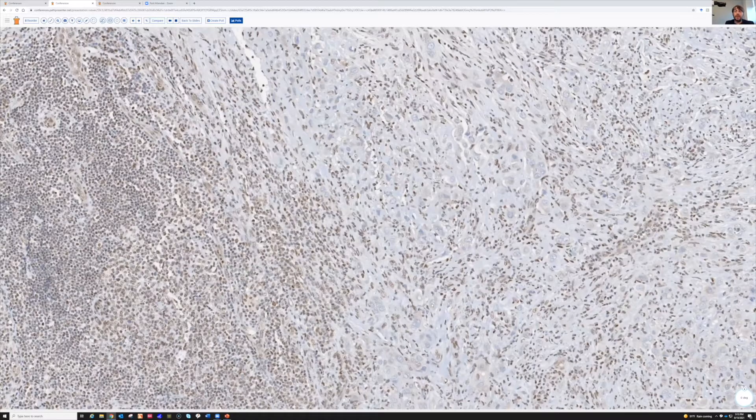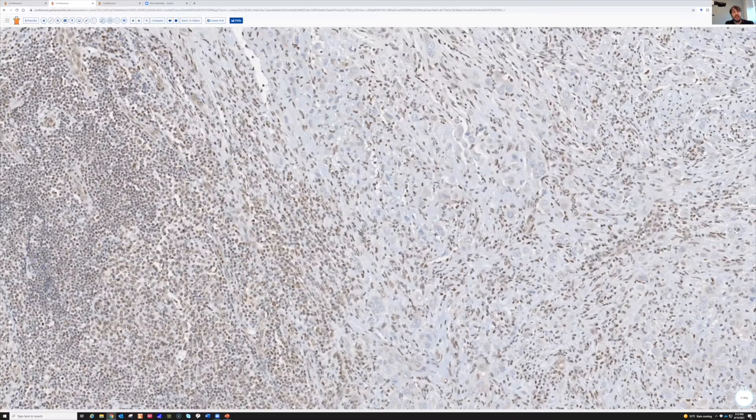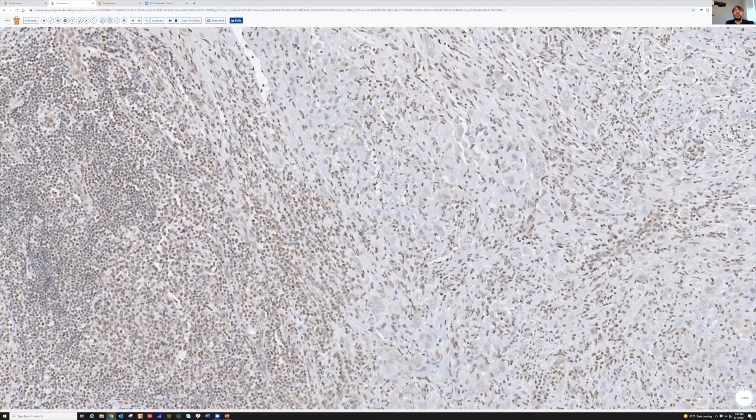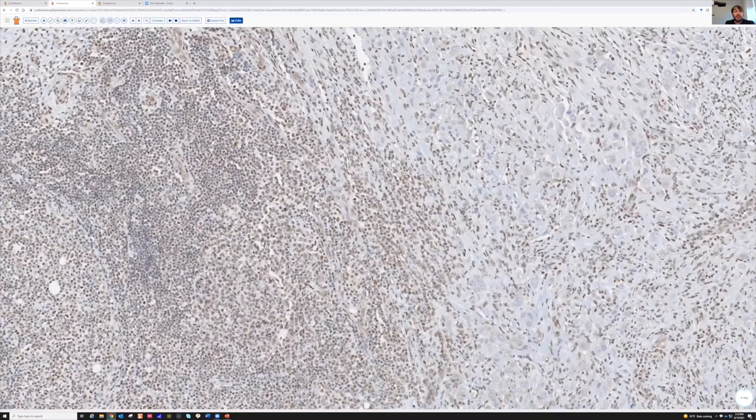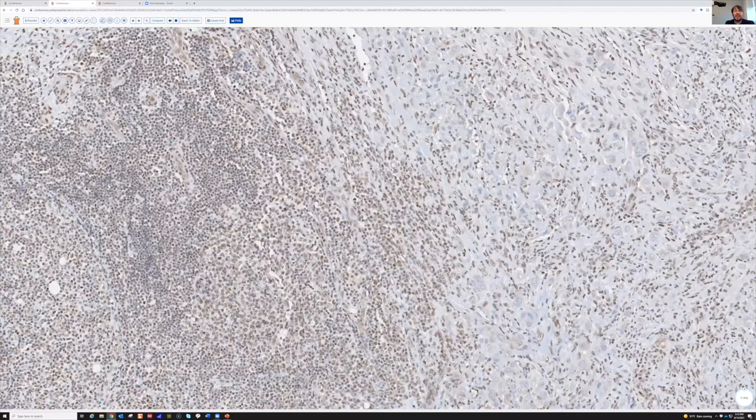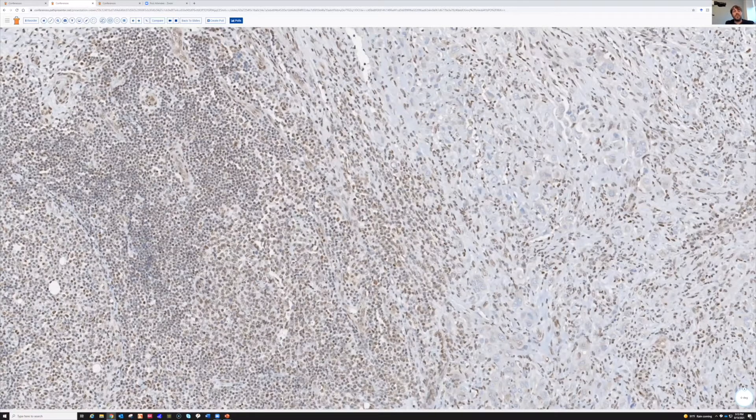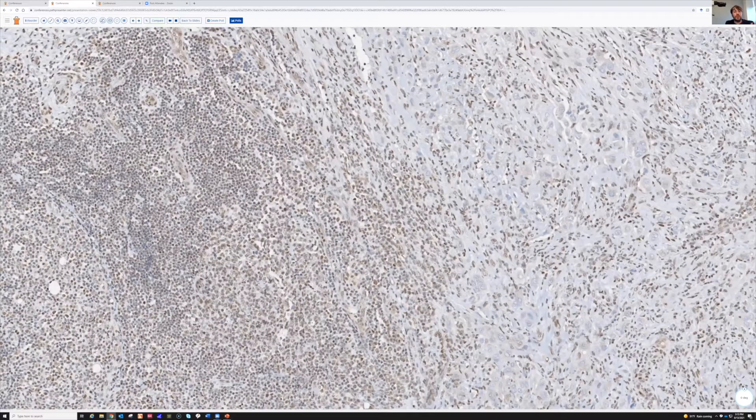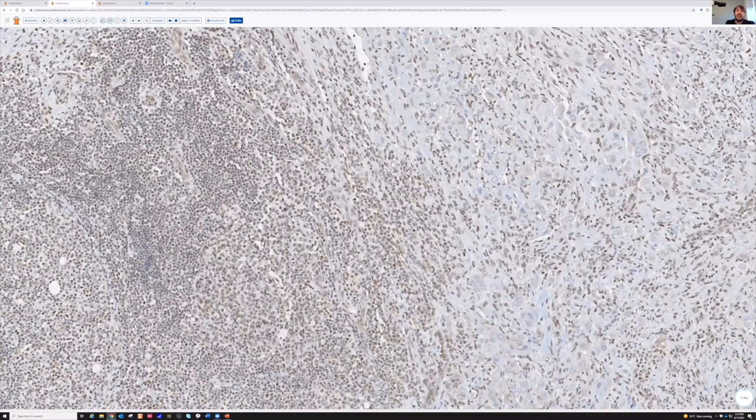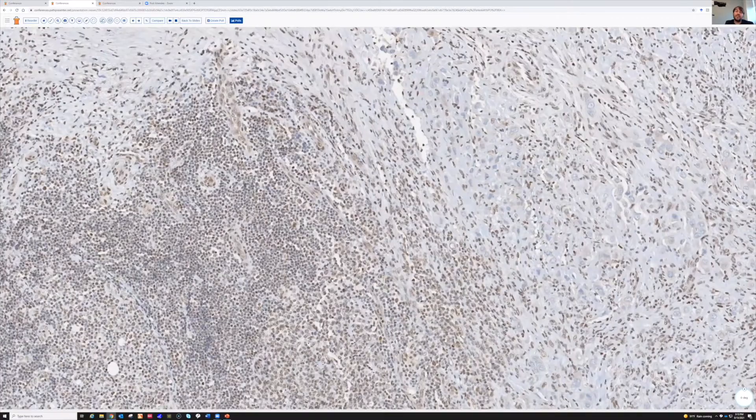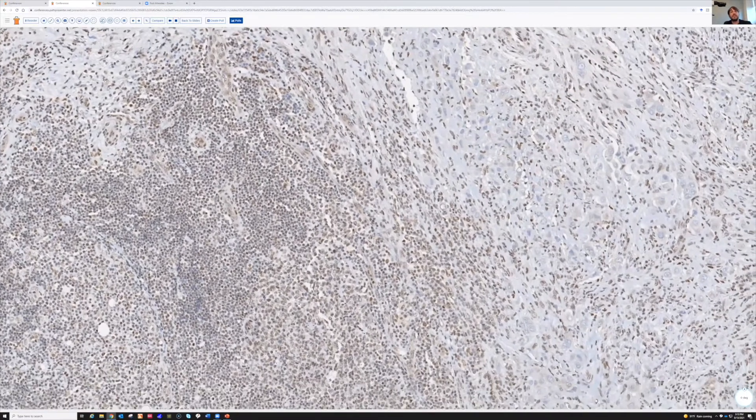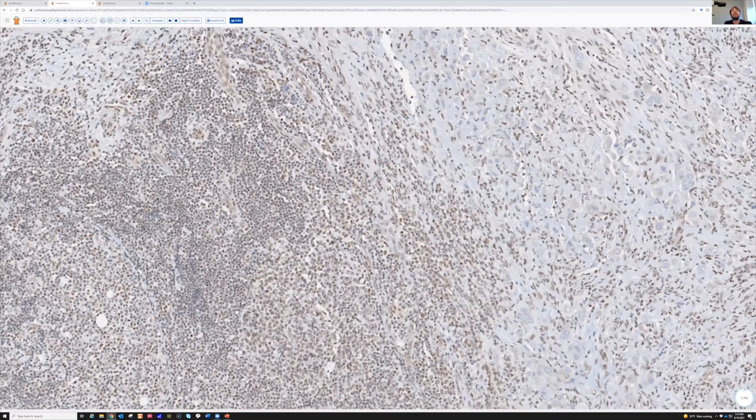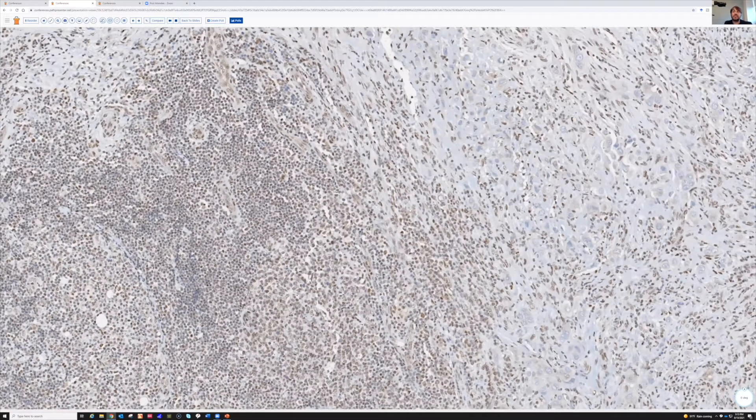So I do think that INI1 is a little bit of a tricky stain. I feel like it should stain most of the nucleated cells in the body, with the exception of the tumors that have INI1 or SMARC-B1 loss. But I do think sometimes it's not like super strong, crisp staining in all the background cells. And this has been in multiple labs, I found this to be the case. But usually when it's lost in the tumor cells, it's obvious.